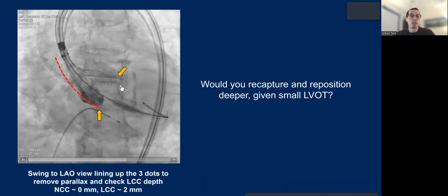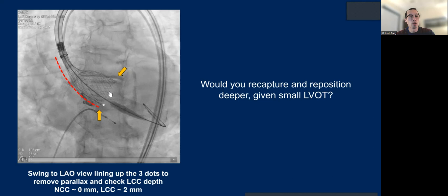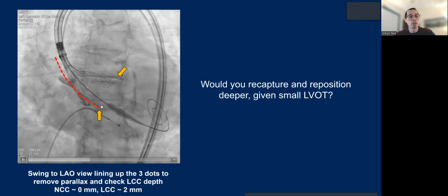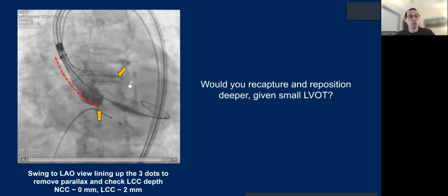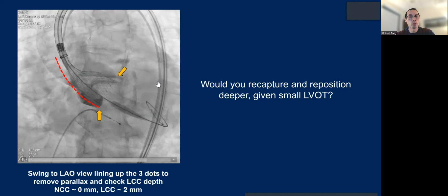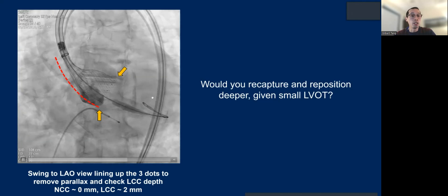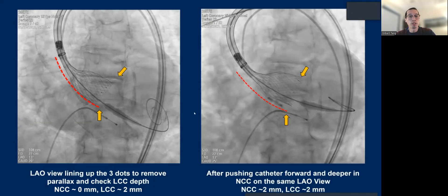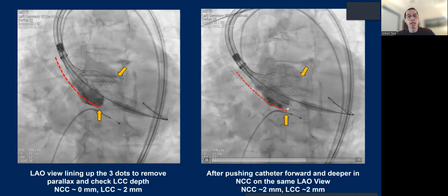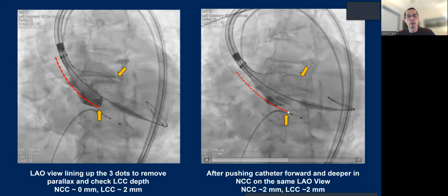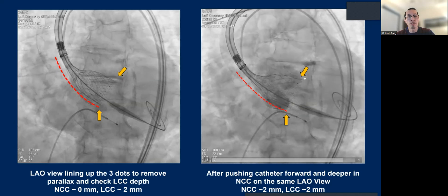Despite trying to do that, you can see initially the inflow is quite high — zero on the non-cusp, and about 2 millimeters on the left on the LAO view. The question is: would you recapture and reposition deeper because of the small LVOT and risk of pop-out? Typically most people would say yes, you need to recapture. However, what we discovered is that the first operator just pushed the catheter forward, and it actually gained at least 2 millimeters of depth on the non-cusp without compromising the left cusp — it did not pivot upward.